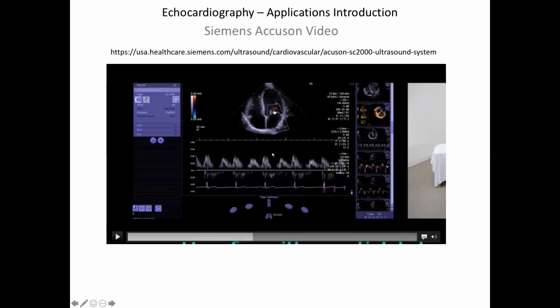Here we have basically a window within which we're going to compute Doppler values. And you can change the depth of the window, and then produce a picture of the velocity spectrum down a specific line, right?